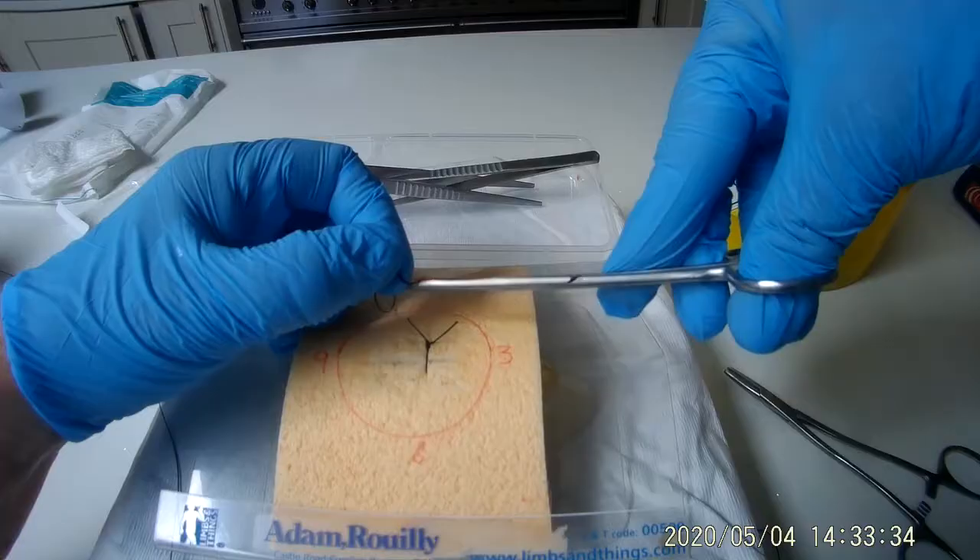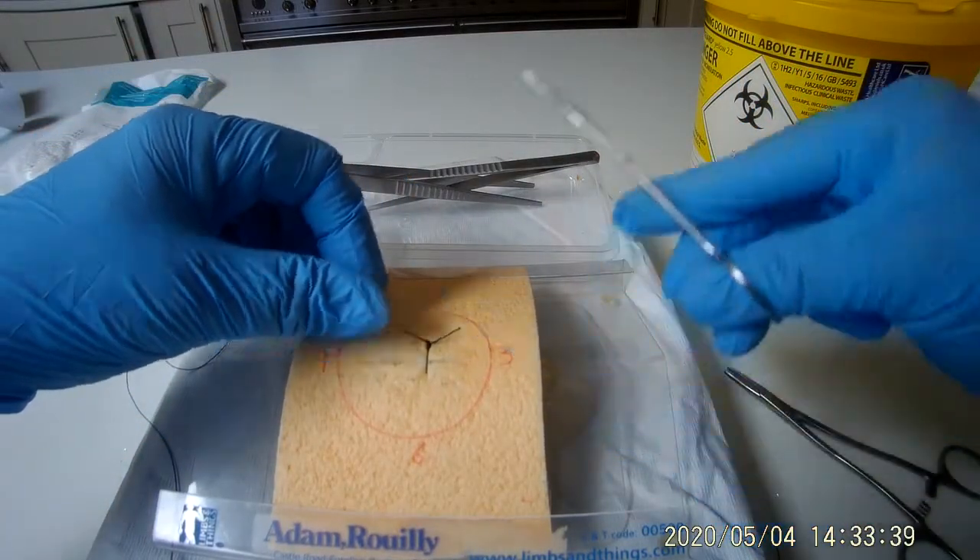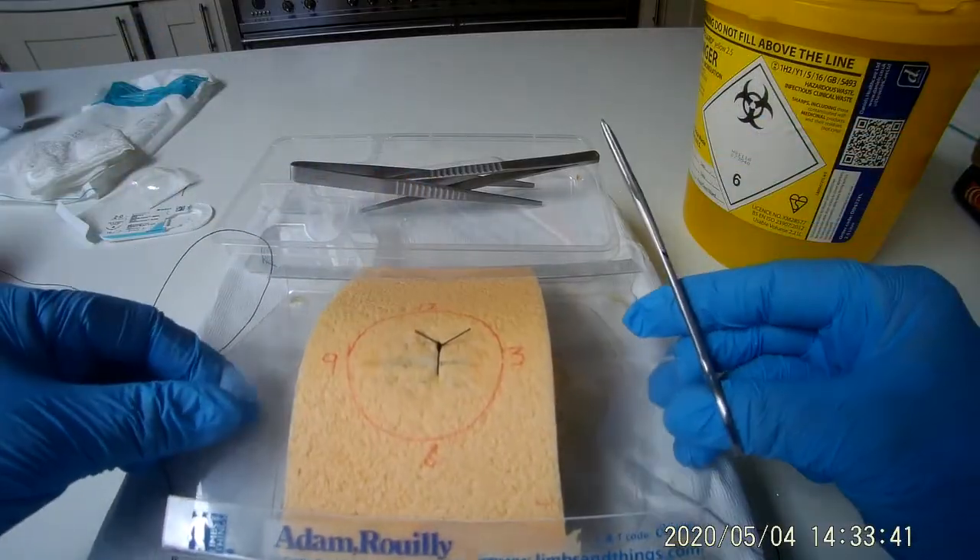Please note this video will only focus on instrument handling and tying an interrupted suture. You will learn how to do the full procedure in part two.